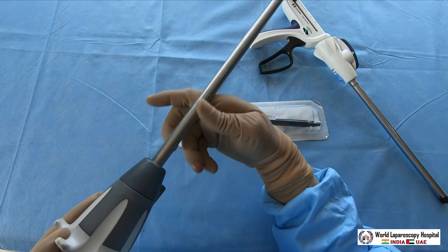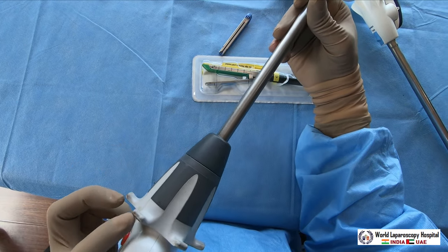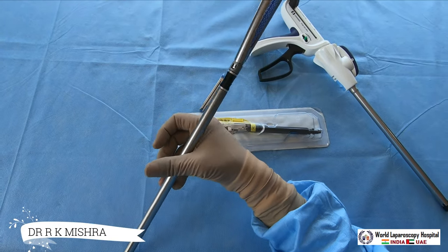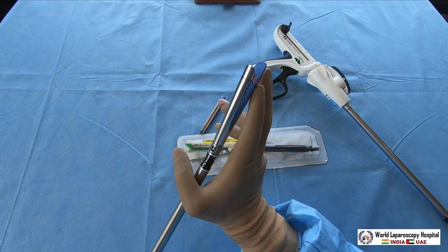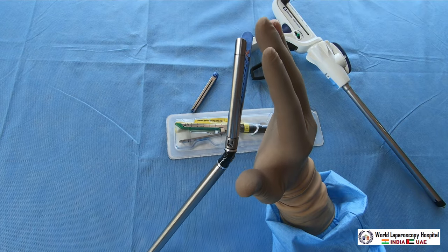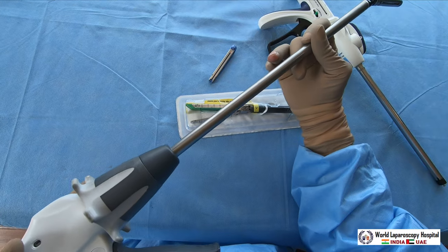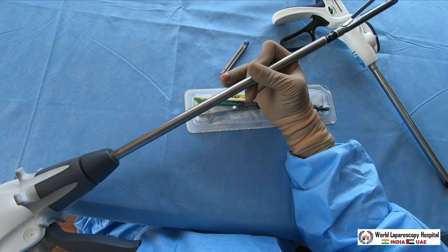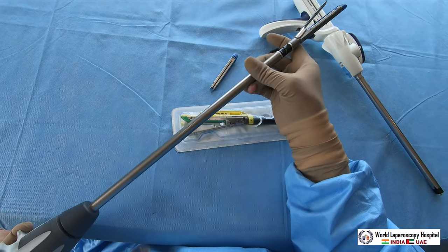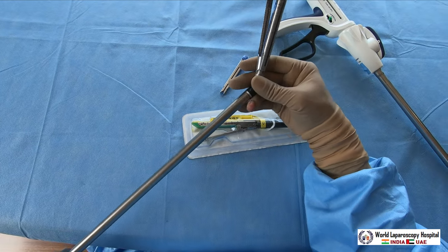Now I will demonstrate how the tip works. This knob is to rotate - once you rotate it, the tip rotates. To articulate, you press it and the tip will articulate. You press it over the abdominal wall and it will articulate. To straighten it, you press and it gets straightened. You can pull it and then press it against the anterior abdominal wall or lateral pelvic wall to articulate in any direction.